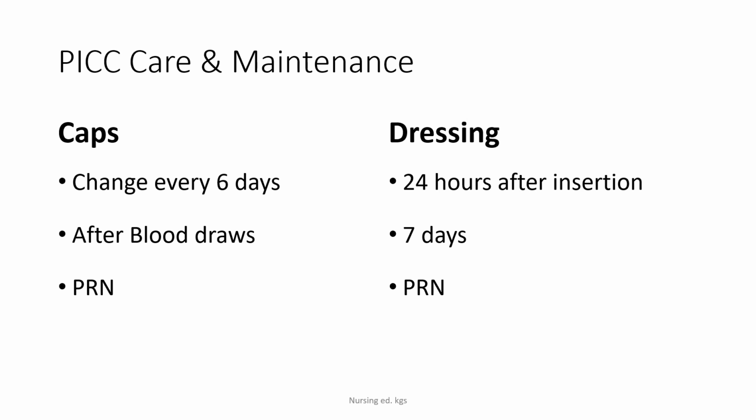Also remember that you need to clean the insertion site with either 2% chlorhexidine or 70% alcohol swabs. You'll be changing that initial dressing 24 hours post insertion, and if it's a gauze dressing, it's changed every 48 hours. The transparent dressing that you will apply will be changed every 7 days.